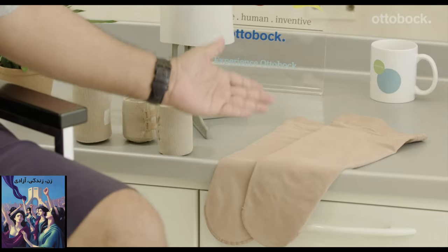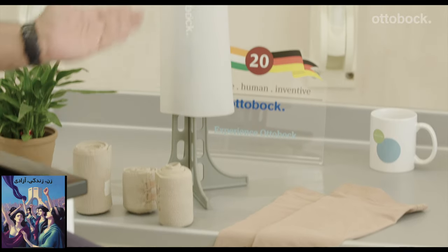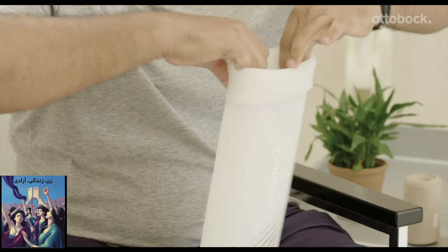If you are a recent amputee, compression therapy is really important. You could use compression socks, compression bandages, or a compression liner. Today I'll demonstrate how to apply compression therapy using a compression liner.